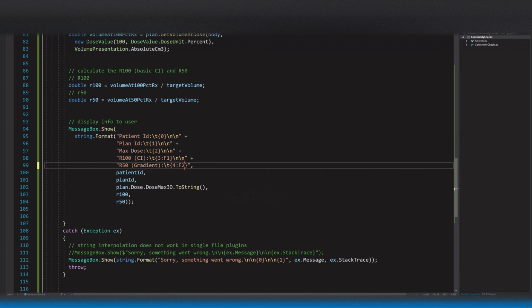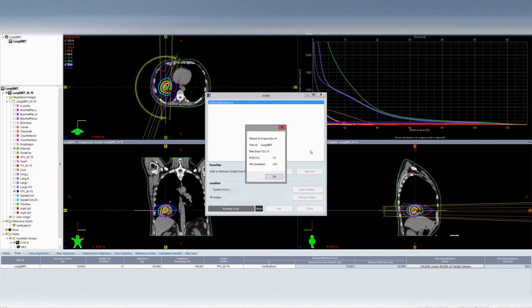Now, keep in mind that this does not round the numbers. It just creates almost like a substring with that many values, okay? So we wanted to add another tab here, so let's try that. Get them hopefully underneath each other. And then we change the number of decimals, but just remember it's not rounded. If you want the actual rounded value, then you would probably need, well, I should say to my understanding it's not rounded. I think it's just like a substring basically. And we could test that, but we're not going to test that right now, okay? Okay, there. So now it's right over each other.